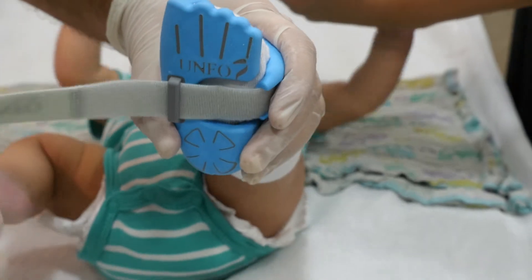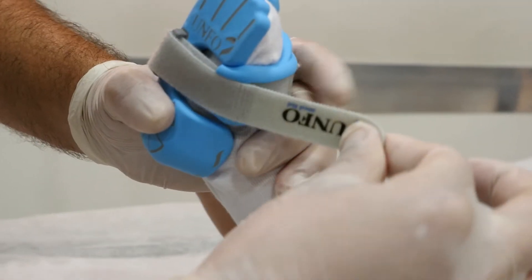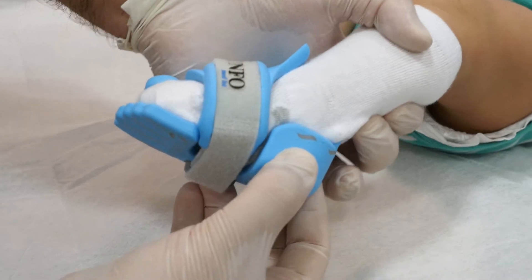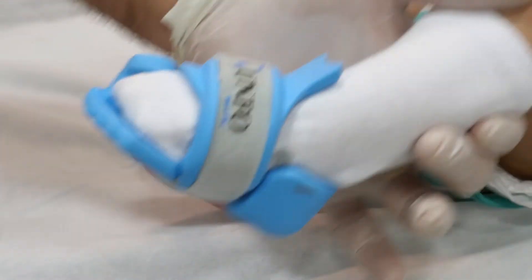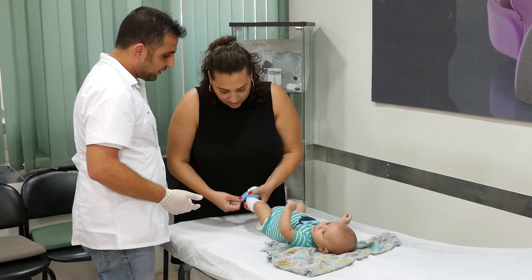Thread the strap and stretch it over the foot and the brace's body. Don't over-tighten the strap forcibly — tightening the strap properly will ensure that the brace is fixed and won't move away. After finishing the setup, remove the brace from the baby's foot and ask the parents to try and perform the setup by themselves until they perform it correctly.